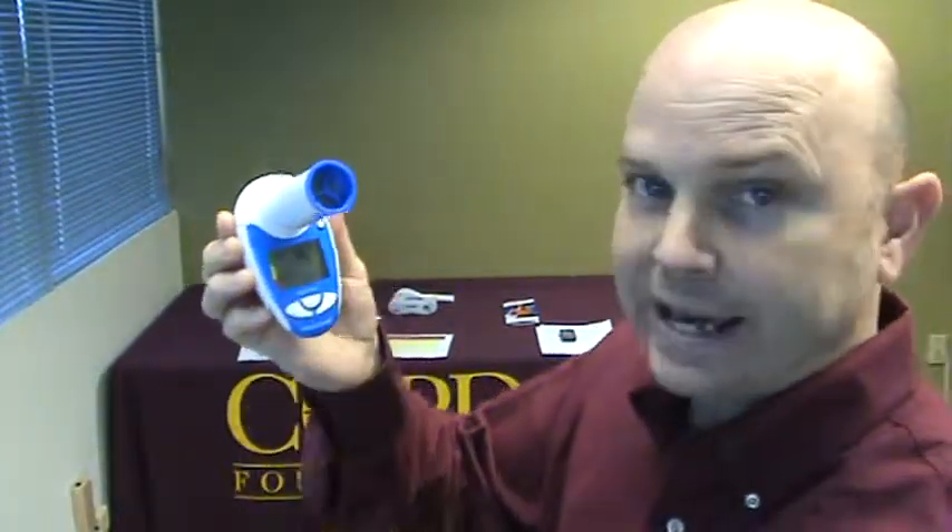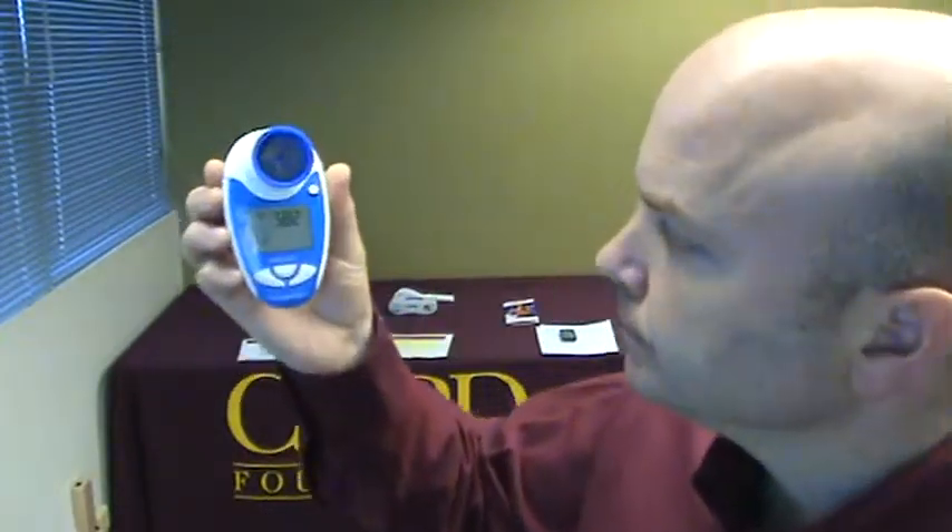The value comes up. Peak expiratory flow is 582 on the first blast. Do it again — icon is ready — 600. Ready again — 533. So the best of those three maneuvers was 600.